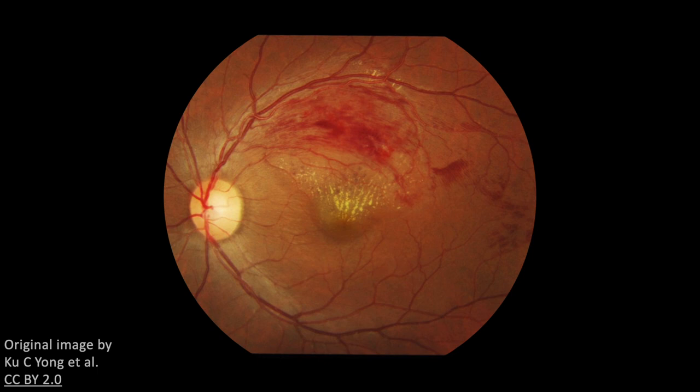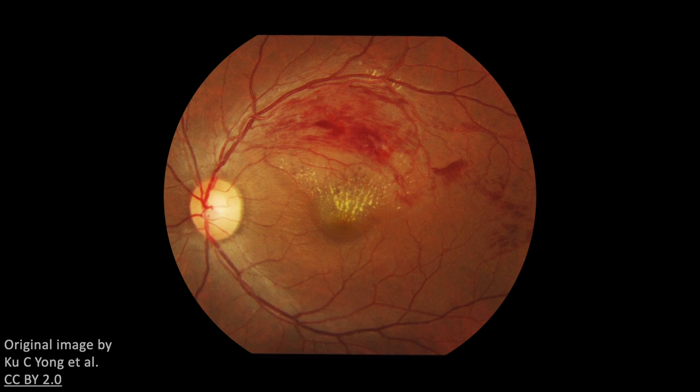There are also hard exudates, that is, yellow-white deposits, due to macular edema. Cotton wool spots are also common with a retinal venous occlusion.